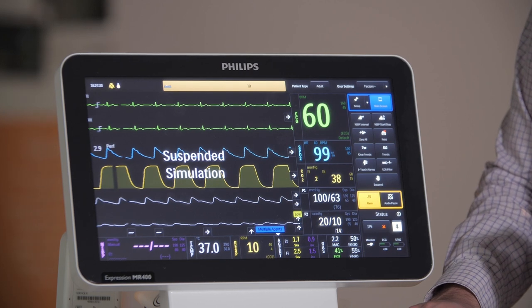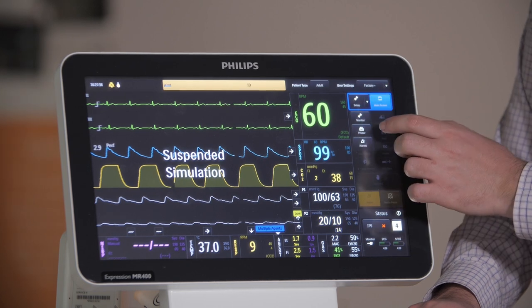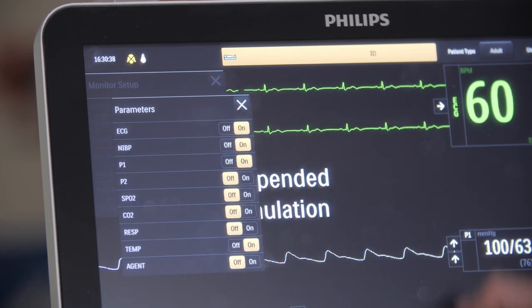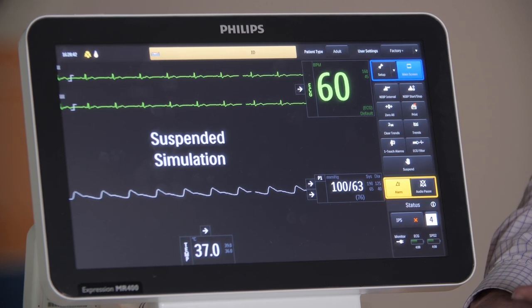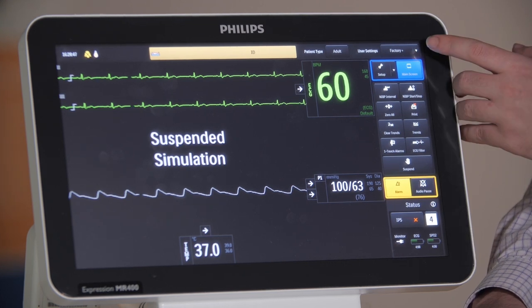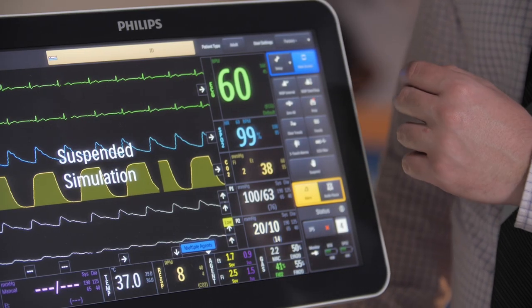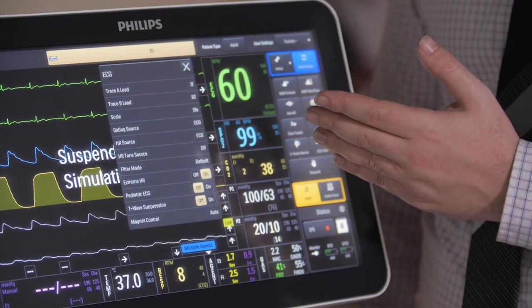If your patient doesn't need monitoring of all of these vitals, you can remove some of the parameters by going into setup, monitor, parameters, and then selecting the ones that you don't want on the screen. To save you from having to change the parameters, alarms and all other various settings every time you get a new patient, we can expedite this process by creating a user profile in the user settings options. If you need to change any settings of an individual waveform, simply touch the vitals box that corresponds with that waveform and a list of settings comes up.